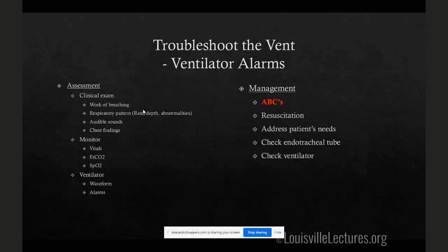If not, begin resuscitation. And then from there, once you stabilize them, make sure that the patient has been checked out, the patient's ETT has been checked out, and the ventilator has been checked out.